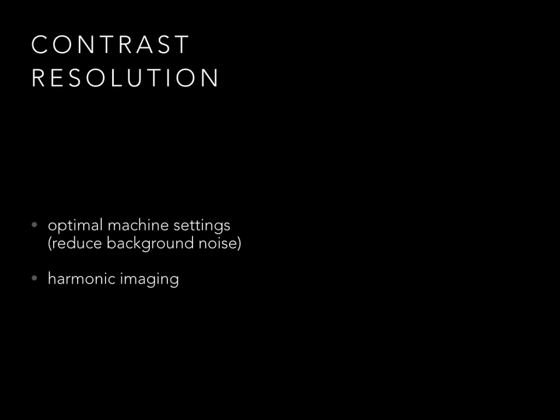Contrast resolution means differentiating between subtle differences in echogenicity between structures. This can be improved with optimal machine settings and using optimal gain. Harmonic imaging also improves contrast resolution.